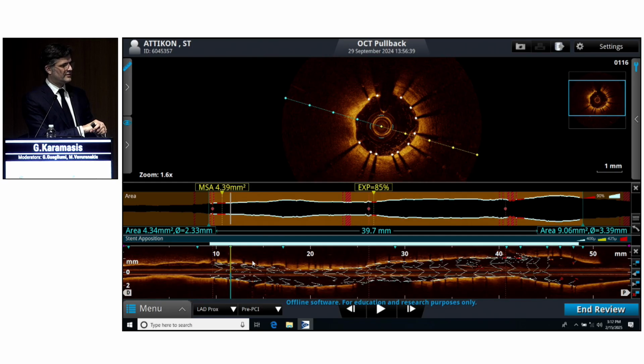So practically speaking, it was trying to get the OCT catheter down, but as was mentioned before, there was some clear protrusion, and then perhaps there was also some distortion. At the end, it was crushed by using the balloon, so the actionable was based upon angio, and then he did this OCT. Just for understanding, first of all, the central part, that is not obvious.